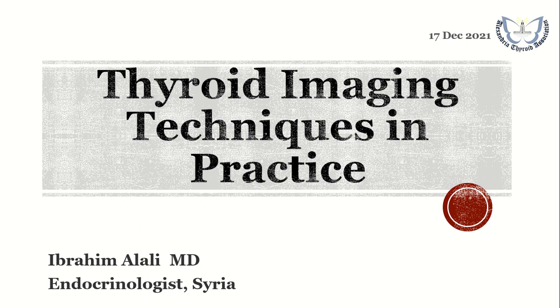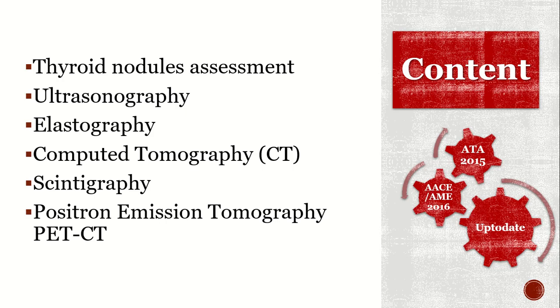As you know, today I will be talking about thyroid imaging techniques in practice. We will take thyroid nodule assessment, ultrasonography, and some ancillary imaging techniques like elastography, computed tomography, scintigraphy, and PET scan.